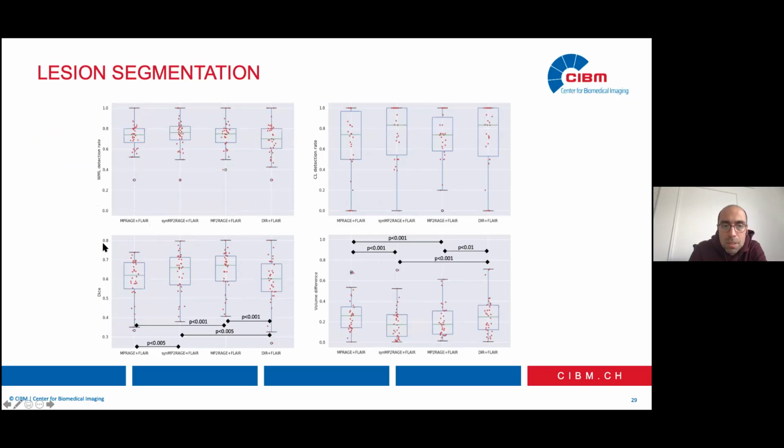I have one question about the fact that the synthetic images improve the segmentation performance. That's quite surprising, because one imagines that all the information needed for the synthesis is in the first image, yet we're not able to create a segmentation algorithm that does better than with the synthetic image. Do you have any insights into that? Is that an optimization problem?